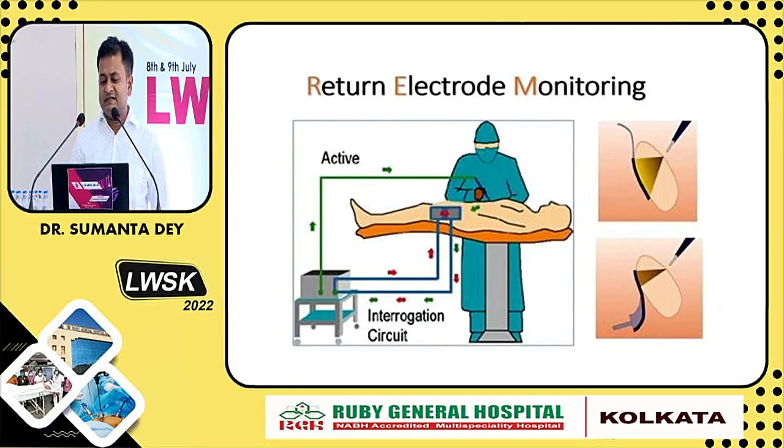Return electrode monitoring is used when we use a split return electrode, where there are two wires. Sometimes while using monopolar cautery, this return electrode pad may come off. If it comes off from the body of the patient, the electrosurgical generator will automatically stop. Even if you press, the current will not come. There is an interrogation circuit which controls the delivery of electrons from the active electrode. If the return electrode pad is dislocated or partially comes off from the body, the interrogation circuit will inform the generator and it will stop delivering current. Then there will be an alarm and a color change in the generator, and you will get to know. So these are the newer things developed.